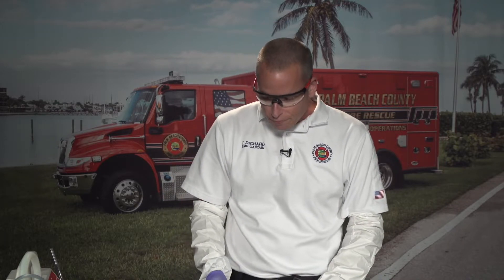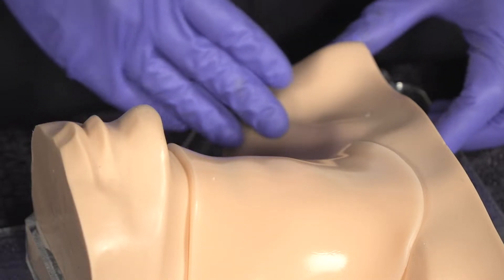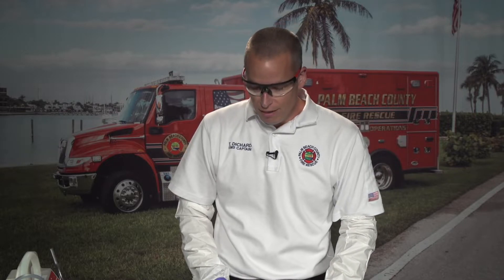When performing this procedure — or any advanced airway procedure — you should wear a minimum of gloves and eye protection. This procedure can become messy, so I recommend trauma sleeves and full facial protection for BSI. You would have all equipment assembled, the patient properly positioned, and prepared per protocol with any sedation and pre-medications that need to be given.